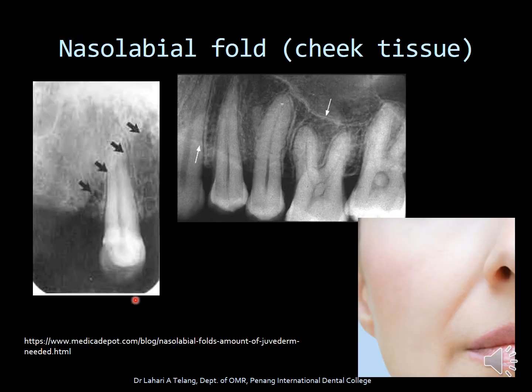The nasolabial fold is the fold on the cheek that is visible as cheek tissue, giving the appearance of a soft tissue shadow on the maxillary radiograph, especially in the canine-premolar region, as a radiopaque shadow.